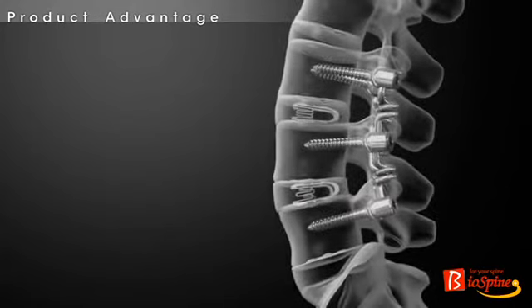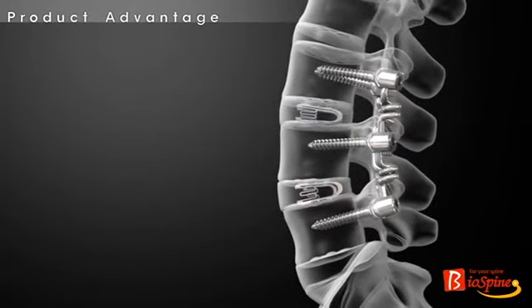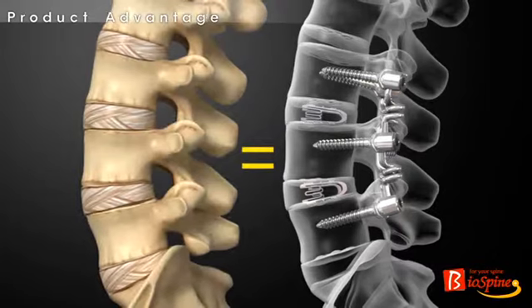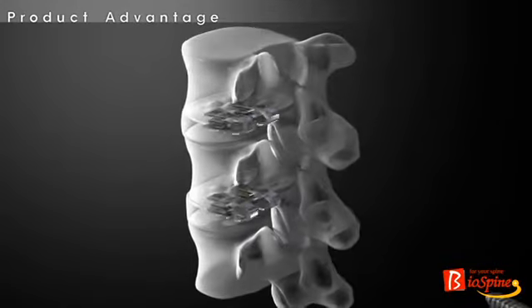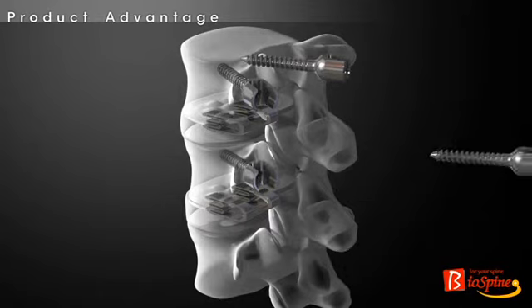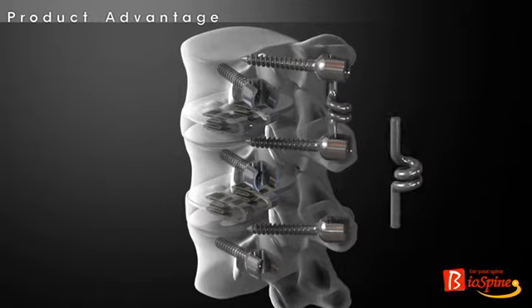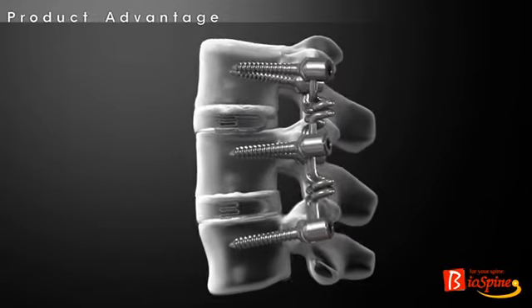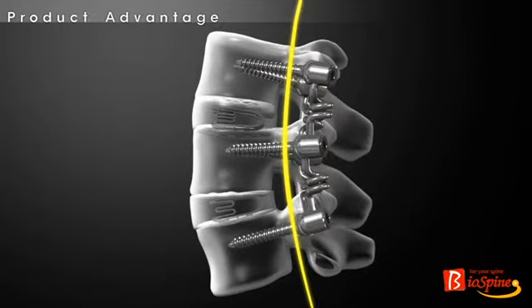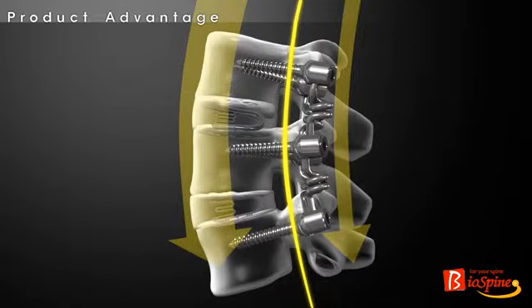The flexible cage system makes it possible to achieve functional recovery in biomechanics, similar to the normal load transmission mechanism. When the flexible cage system is applied to the anterior part of the spinal column, if the BioFlex spring rod system by flexible rod is applicable to the posterior part of the spinal column at the same time, the facet joint of the posterior part and the intervertebral disc of the anterior part can function normally in terms of shock absorption. Therefore, the load-sharing ratio of the anterior part and posterior part can be restored to the ratio of 80:20, the normal load-sharing ratio.